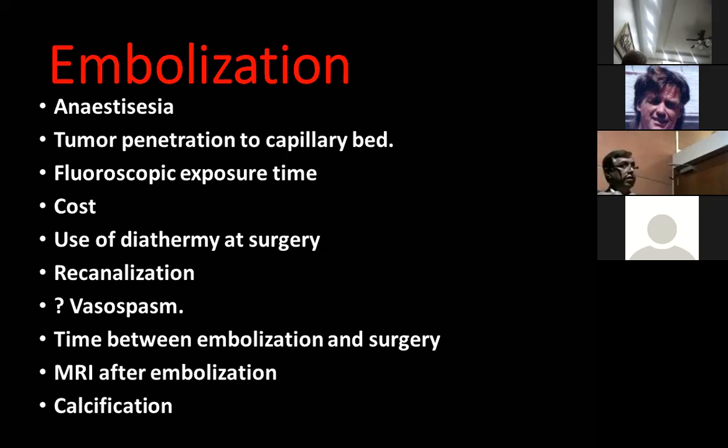And whether you go deep into the tumor to the capillary bed to close the tumor vessels, you have to be aware of the fluoroscopic time, because all the time you are exposing the patient to X-rays. So you have to calculate that. And what about the cost? These are very expensive materials. And one thing, there are a few papers about that: with some of these materials, once you operate and use the cautery, you may get a spark and fire.